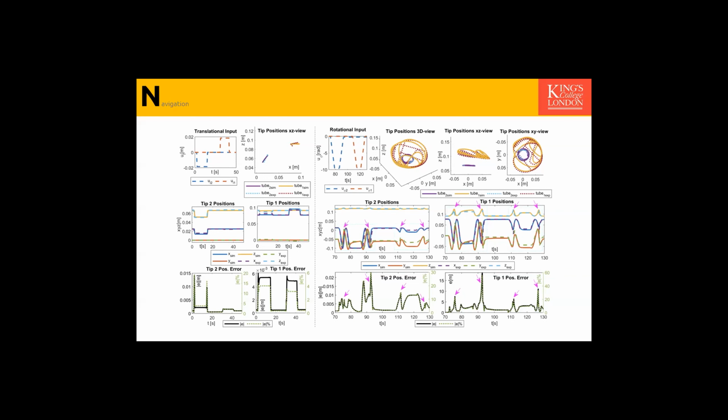In Caleb's work, at the instance of a snapping, you need to switch between 2 different solvers. But in this one, I have a unified solver. It just runs, and it gives you results. It just becomes a bit slower during the snapping instances to converge, but it runs. So that's one of the benefits. And does that result from your... Oh, sorry. The other thing is, Caleb focused on the accuracy of capturing post-snapping vibrations. We didn't care about that, to be honest, here, and we had an overdamped model to go through snapping successfully.